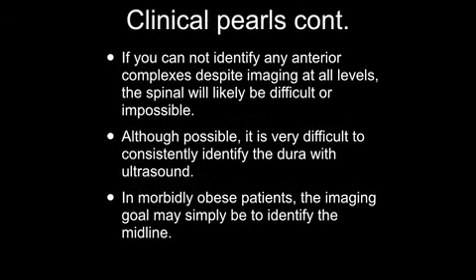If you cannot identify any anterior complexes despite imaging at all levels, the spinal will likely be difficult or impossible. Although possible, it is very difficult to consistently identify the dura with ultrasound. In morbidly obese patients, the imaging goal may simply be to identify the midline.